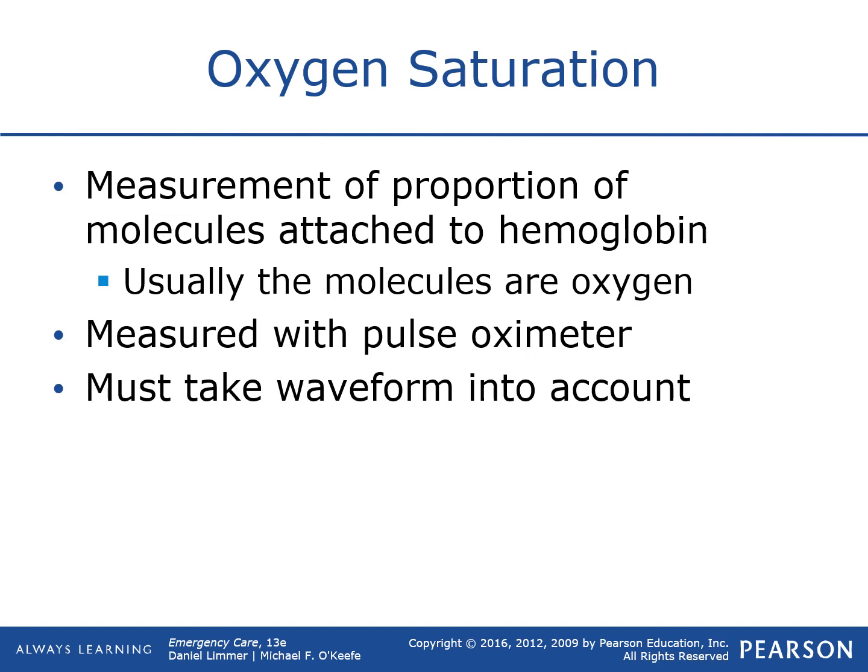And another thing that you need to be very mindful of is the waveform that you see in an oxygen saturation. So when you attach a monitor, it should have a separate bar that will go up every single time that the heart rate beats. And that should go all the way to the top. That is your waveform. That means that it has a good signal. If it doesn't bounce all the way to the top, that means it's not having a good reading. So your reading might be inaccurate somehow.